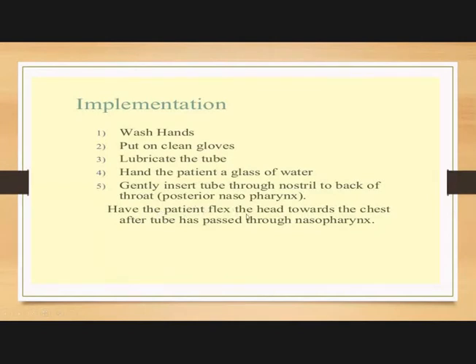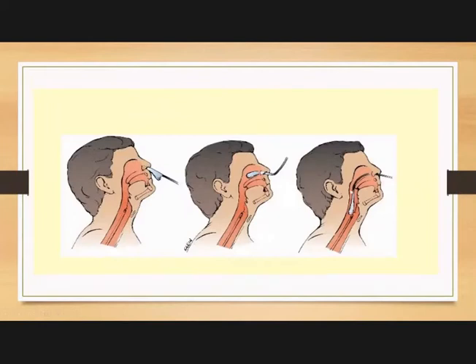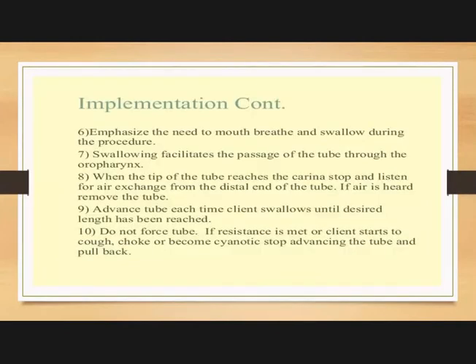Have the patient flex the head towards the chest after the tube has passed through the nasopharynx, like this. Okay. The tube is passed through the nostril in a rotated direction. Ask the patient to breathe and swallow during the procedure.